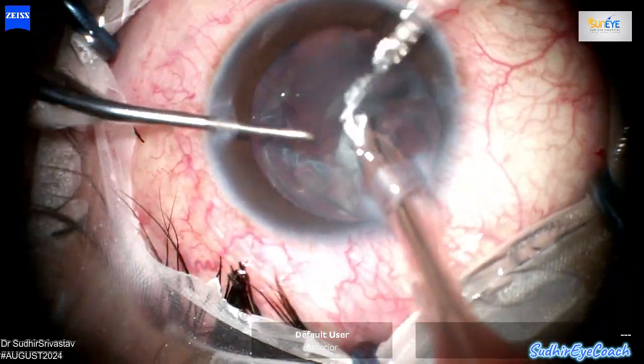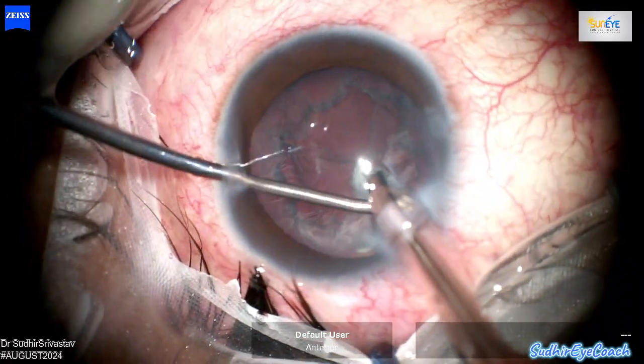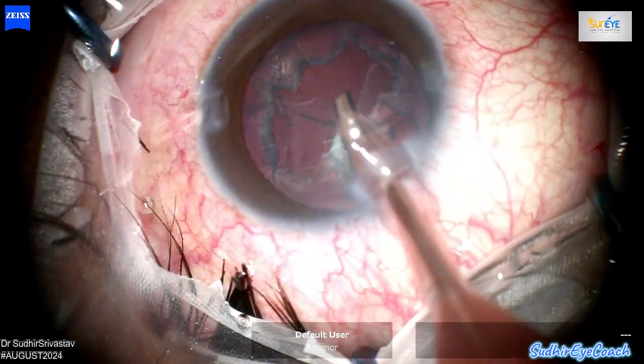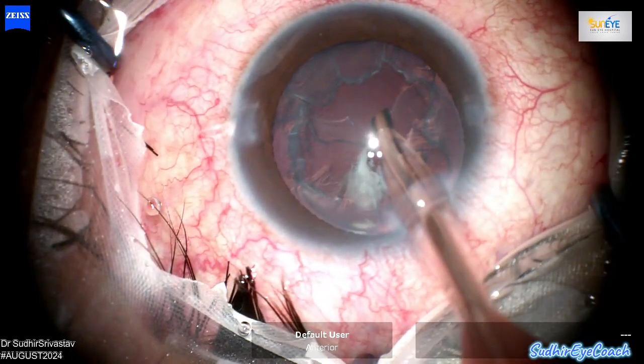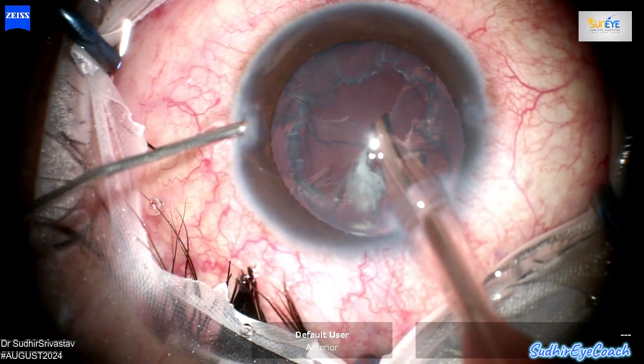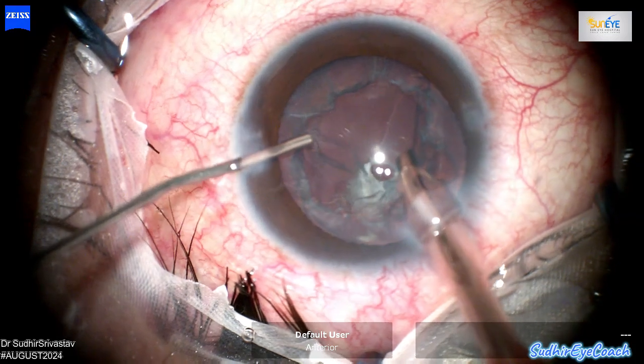Since the nucleus was very soft, I was able to remove it easily. Now I am focusing on removing the thick epinuclear plate, starting from the periphery and working my way inward. This approach ensures safer and more controlled removal while minimizing the risk of stressing the posterior capsule.